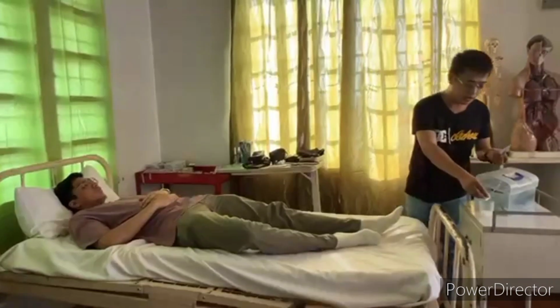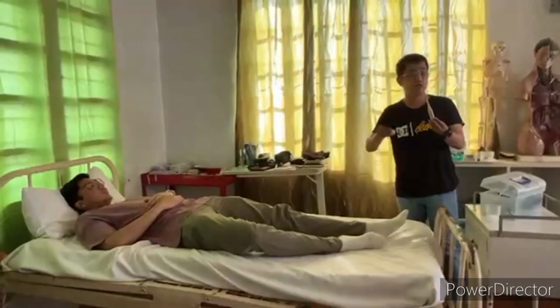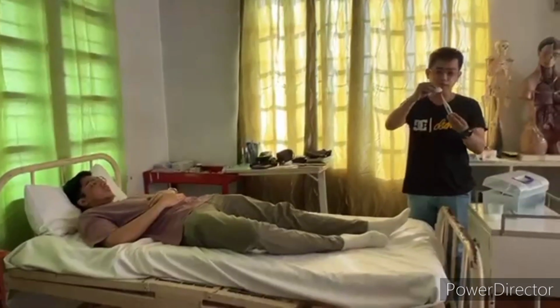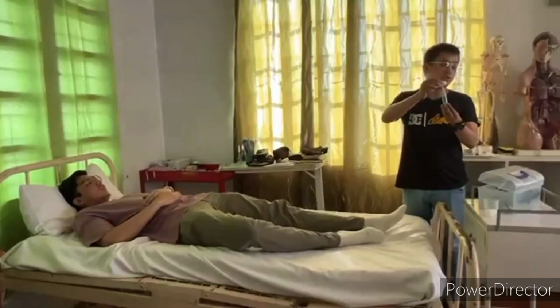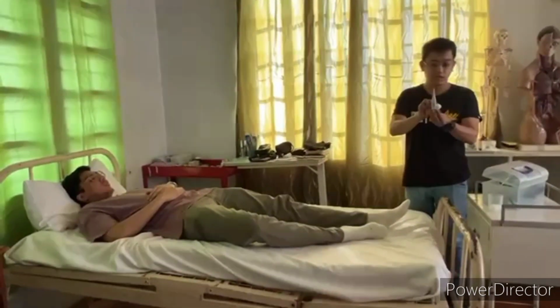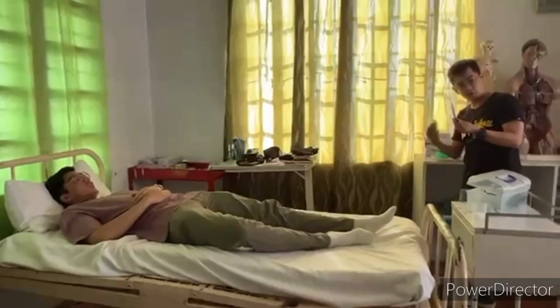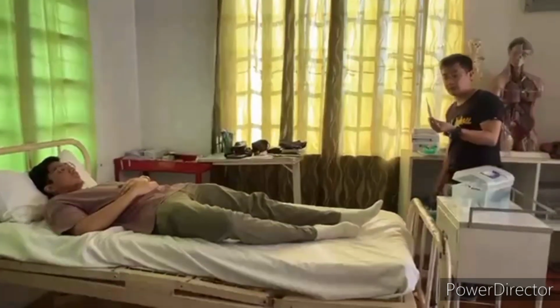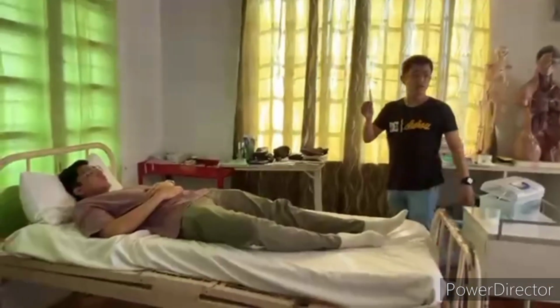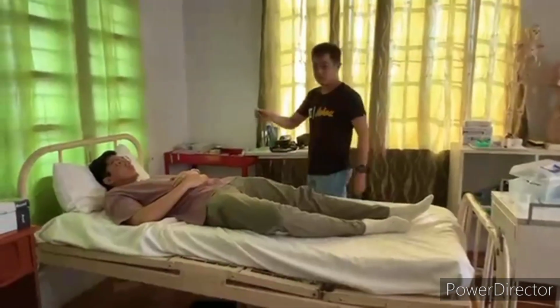So we're gonna get a piece of cotton ball and then clean the thermometer from the tip or from the bulb of the thermometer. So we're gonna move it in a rotary motion until we reach the handle of the thermometer. Okay? Then, we're gonna discard the used cotton ball in the trash bin nearby. So we're gonna hold the thermometer on the handle and then we're gonna give it to the patient.